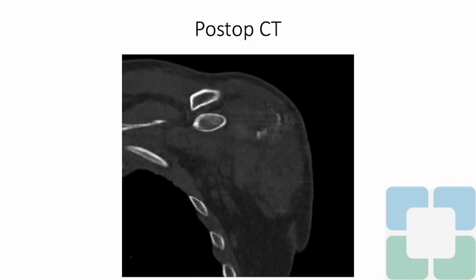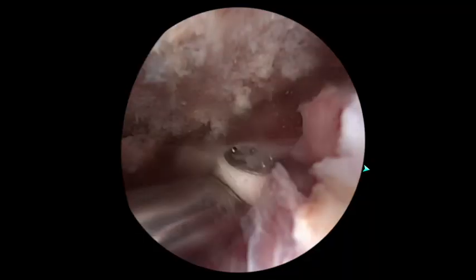We discussed technique options and decided we would do this arthroscopically to try and maximize visualization and suture placement, as well as allow for potential additional anchor placement. The following video demonstrates this technique. The surgery was performed in beach chair position.